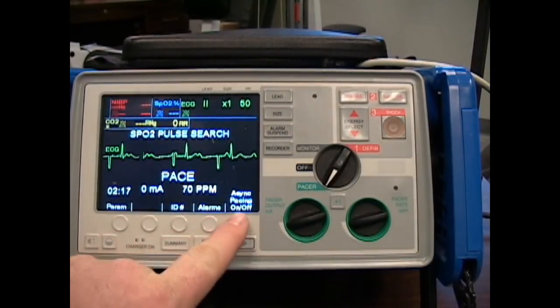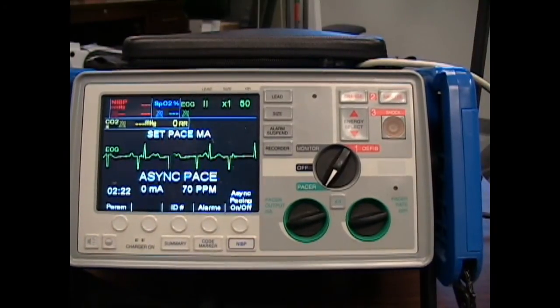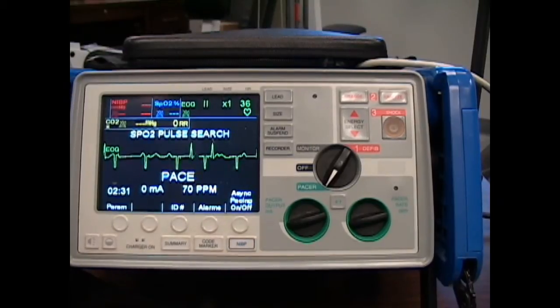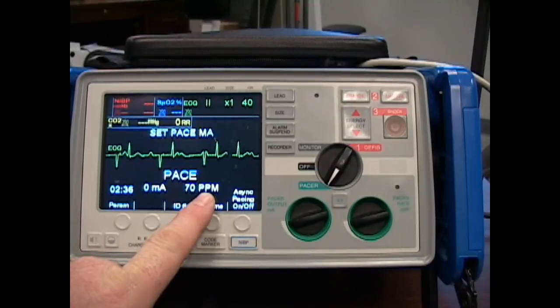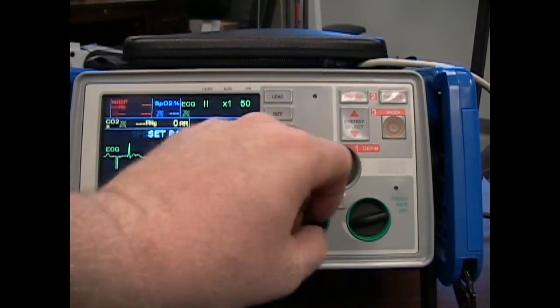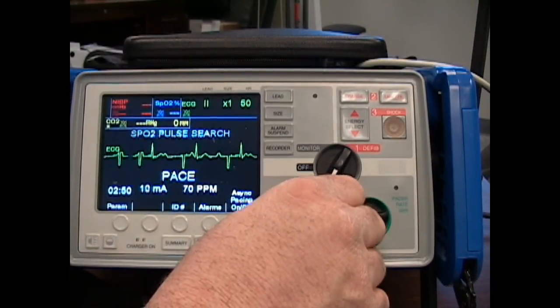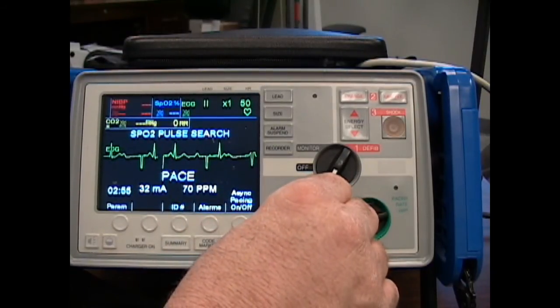Everything we're working with is down here on the very bottom. We do have the Asynchronized Pacing key here — if I turn it on, it says Asynchronized Pacing, which means only the pads are connected. We pop the button again to turn it off. Back in pacing mode: notice the milliamps is set to zero, so we're going to have to control that. 70 is the intrinsic rate set. You can adjust that up or down with the dial. Now we're looking at the actual milliamps — the rule of thumb is go up by 20s until you gain capture.